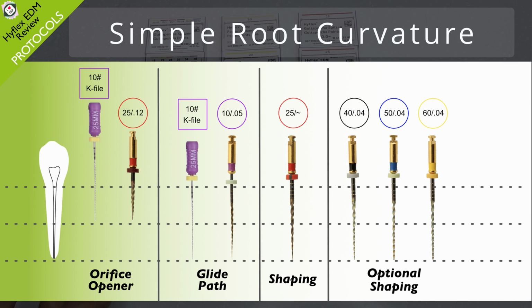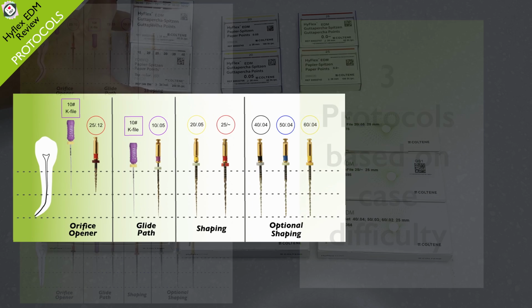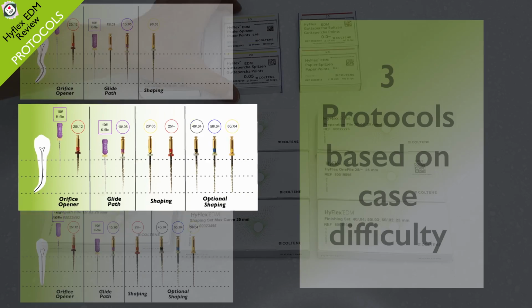shaping set. Its instructions for use is pretty standard stuff, using the size 10 Glidepath file transitioning straight up to the size 25 OneFile. The second protocol is for teeth with a slightly curved root, and the associated shaping set that is used is the medium curve set. And unlike the simple shaping set, this allows for a size 20 file between the size 10 Glidepath file and the size 25 OneFile. Both these protocols suggest possible optional shaping with larger files, but importantly these are not included in these dedicated shaping sets.